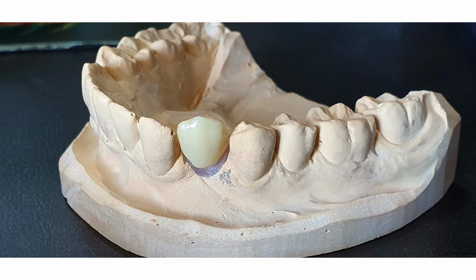We don't want undue canine guidance on this, and we also don't want it traumatizing the lateral incisor. So this will be the topic of the third and final presentation in this series on guided placement of a single tooth.